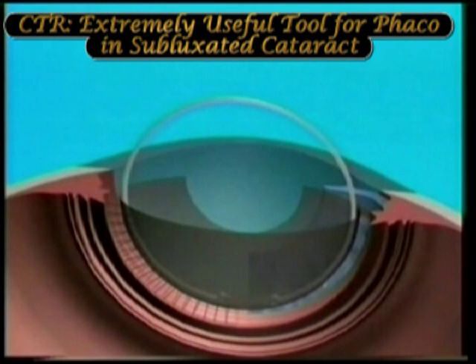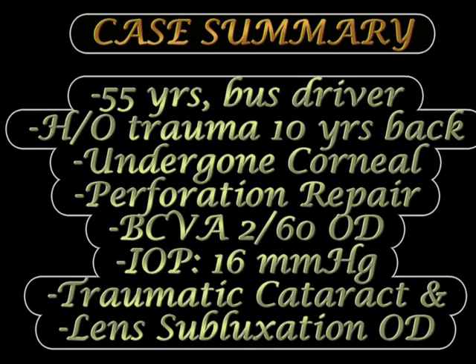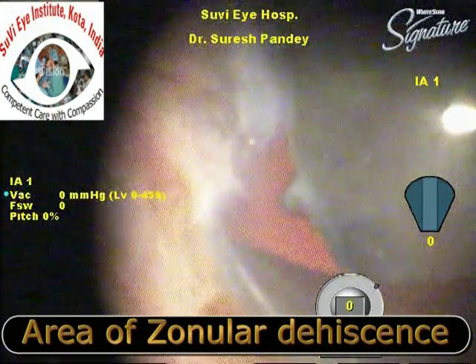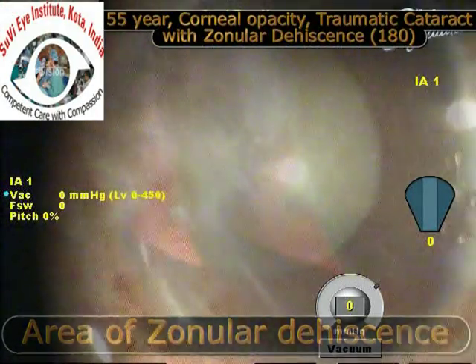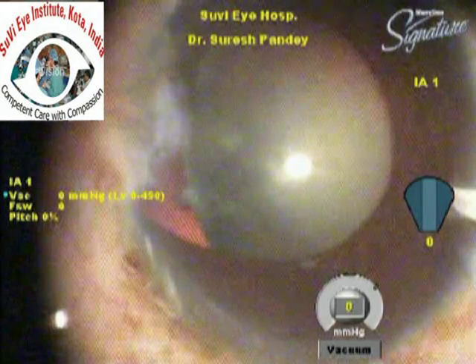The CTR makes the capsular bag uniformly dilated and circular. In this video we discuss the case of a 55-year-old bus driver who had a history of trauma 10 years ago and had undergone corneal perforation repair. He presented with a traumatic cataract with lens subluxation in the right eye and a best corrected visual acuity of 2/60. The area of subluxation is visible, along with a corneal scar where the perforation repair was done.